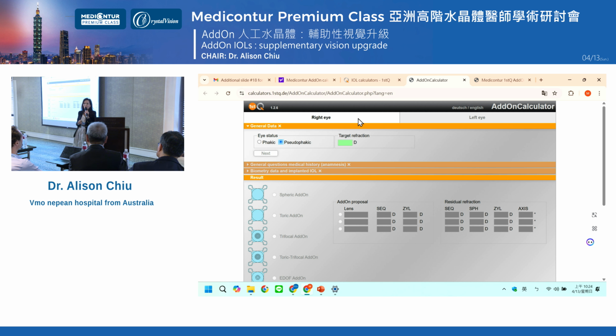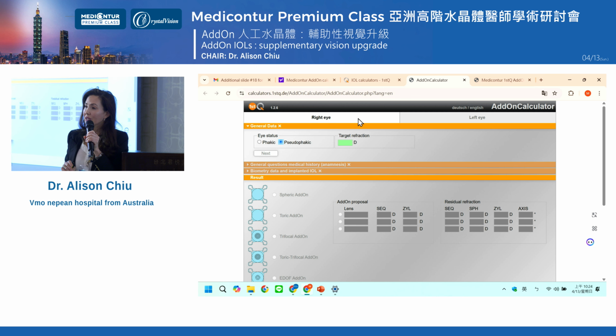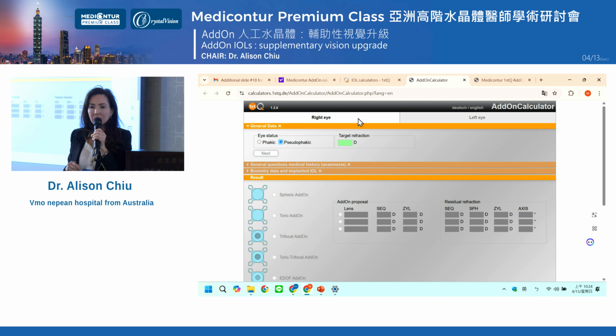That's right. There is a learning curve. It's one of the pearls when learning how to do it, is how to load the lens and make sure that trailing haptic doesn't get caught in the plunger. But again, I agree. I have had a little mishap myself with the trailing haptic, and I've still implanted it, and it's not just well centrated but also still rotationally stable. So it's forgiving in that way.